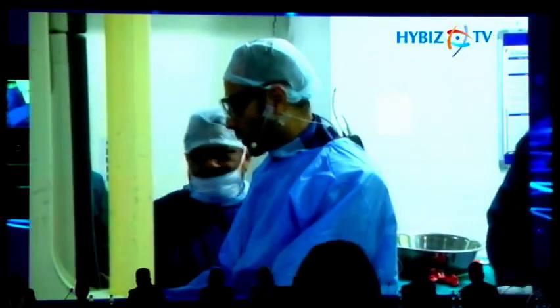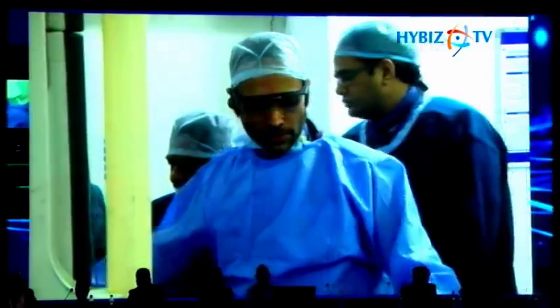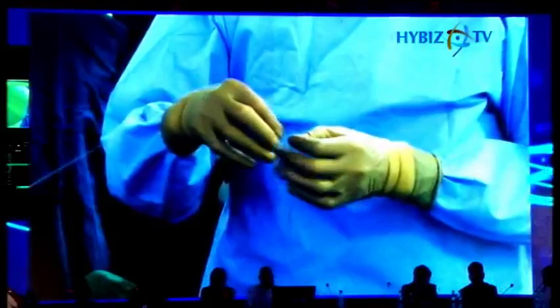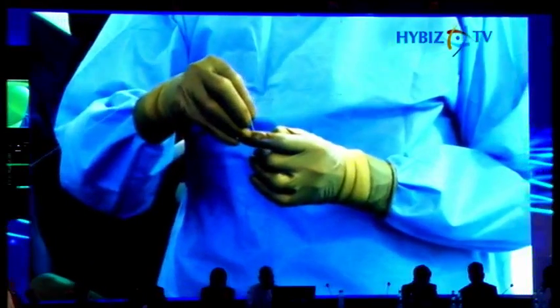So I want you to flush this, okay? It's an over-the-wire balloon, so flush it. I'm going to take out the stylet. Okay, good. Take out the stylet, okay? Please, thank you. Okay, good job. Good. That's it. Don't take that syringe, leave it, okay? Good, perfect. Good job. So trap is still up, right? The side port is with a syringe with the contrast. Side port with the hub.